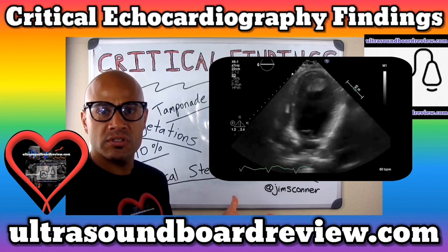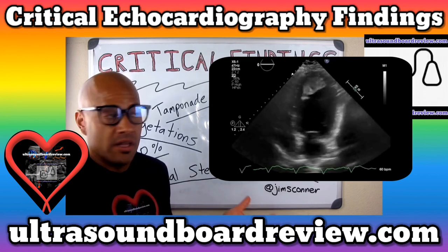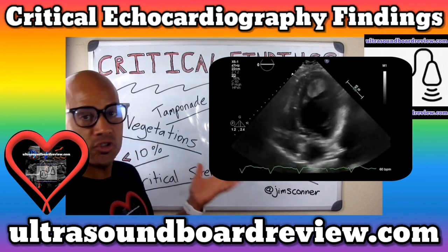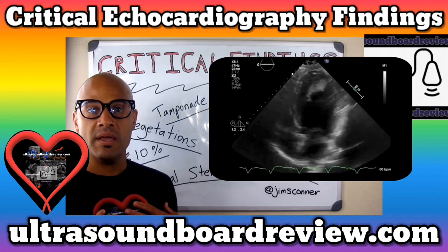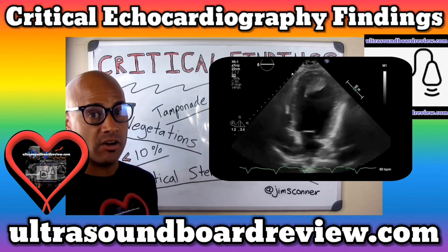What are these structures? Are they tumors? Is it thrombi? It looks like those structures are still there. This tells me that whatever this is, it is not an artifact.